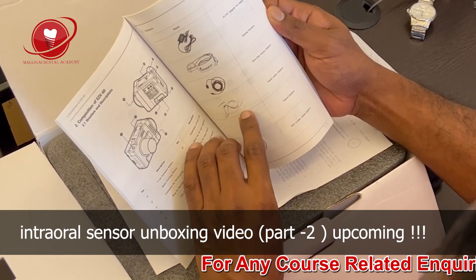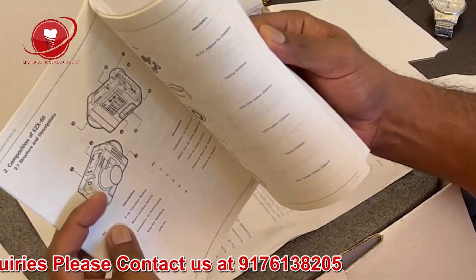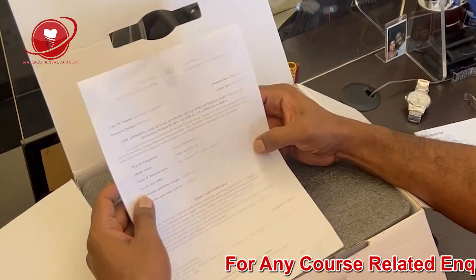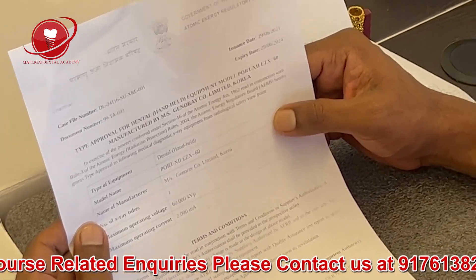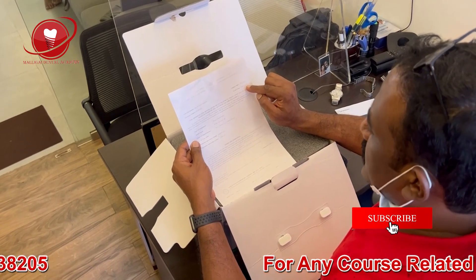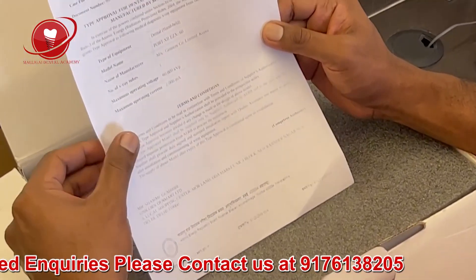There are optional accessories such as intraoral sensors, a hand switch, a tripod, and a backscatter shield. And there is a government letter — this is a type approval for dental equipment, model PORT-XII EZX-60, manufactured by GenoRay. The Government of India Atomic Energy Regulatory Board has authorized this, and the license is valid till 2024. Mr. Shami Gamgir, my friend, the Managing Director of INIC, has been given this authorization because he applied for it.